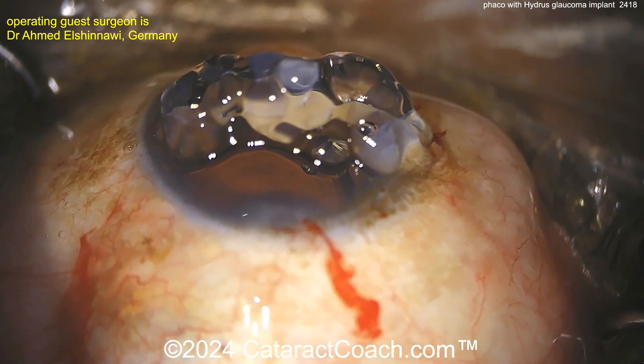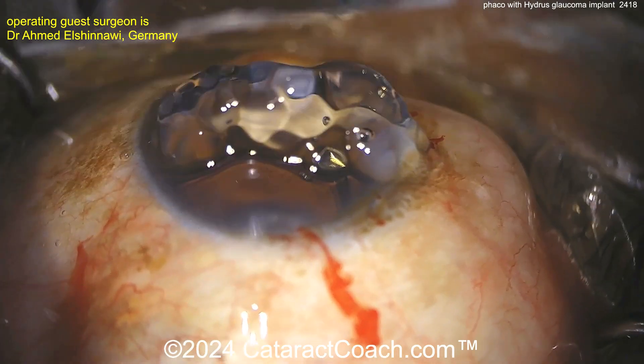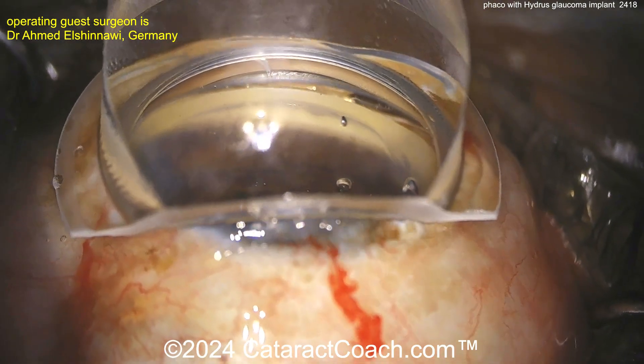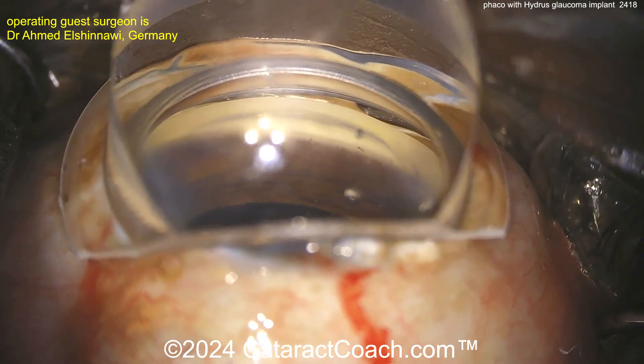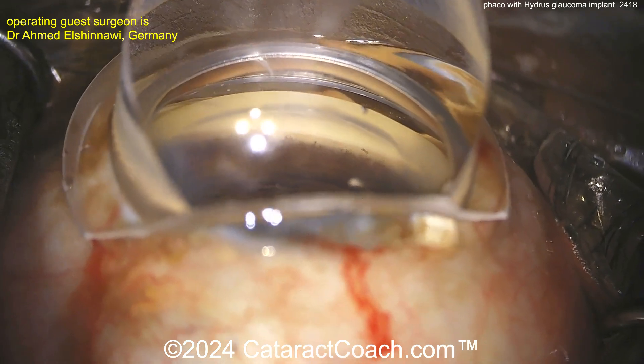The patient's head is turned away from you and the microscope is tilted towards you. Now you can put on your gonio prism — look at that, you get a beautiful view of the angle. Take your time here, get it all centered up, get your focus where you want it.